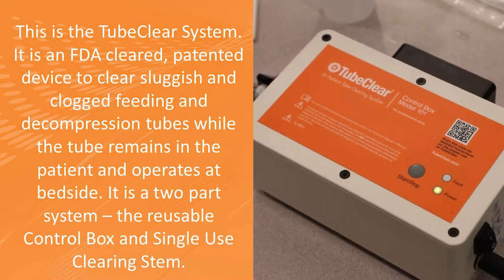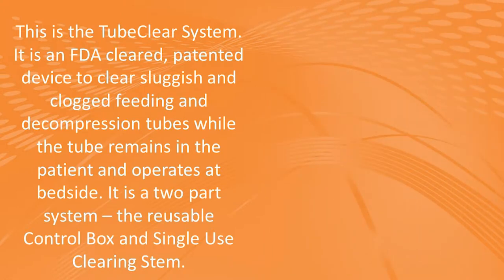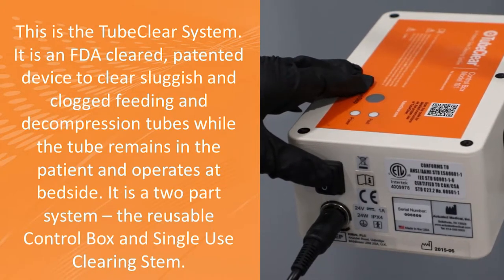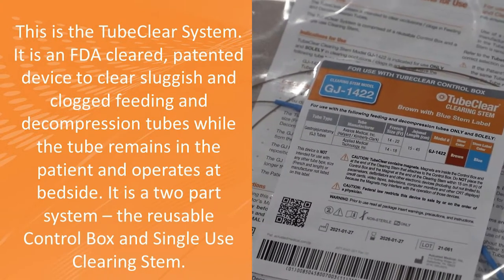This is the TubeClear System. It is an FDA-cleared, patented device to clear sluggish and clogged feeding and decompression tubes while the tube remains in the patient and operates at bedside. It is a two-part system: the reusable control box and the single-use clearing stem.